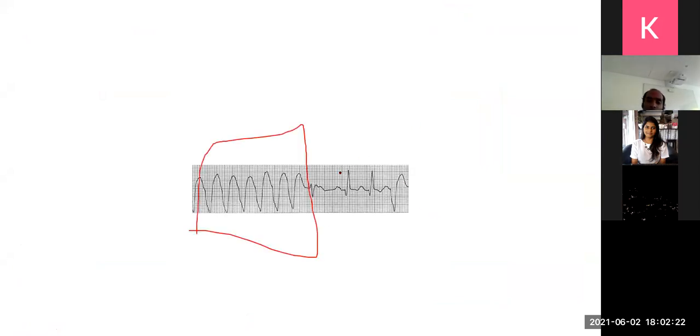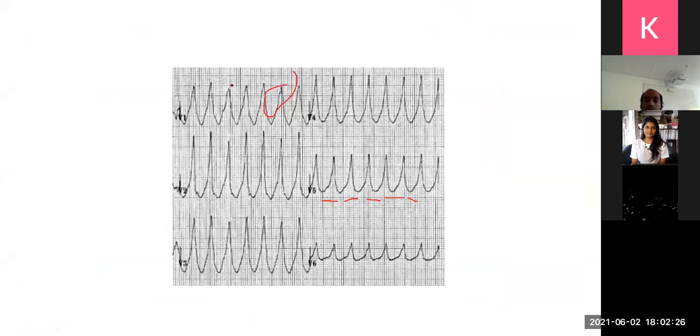Don't worry about that. This is ventricular tachycardia. This again is ventricular tachycardia.